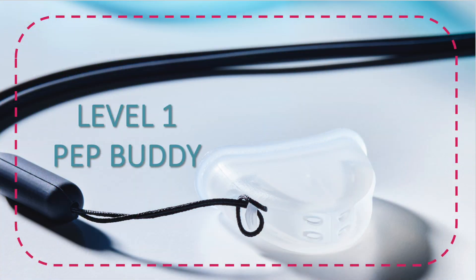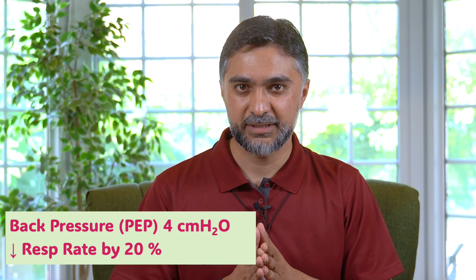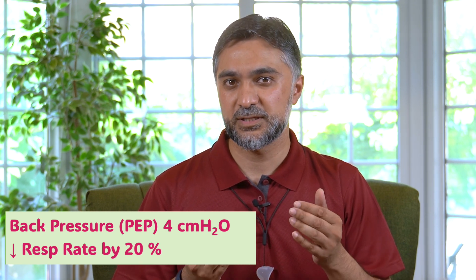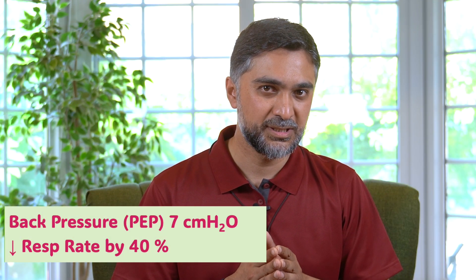Level 1 PEP Buddy gives you a little less pressure — a back pressure of 4 centimeters of water when you're breathing out. It also reduces your respiratory rate by about 20 percent.